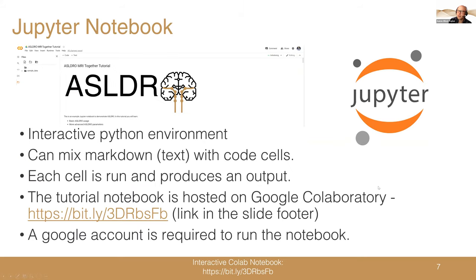Now, the tutorial itself takes the form of a Jupyter notebook. A Jupyter notebook is an interactive Python environment that runs in your web browser. It comprises cells that have either plain text or code that can be run, and you run each cell one at a time.